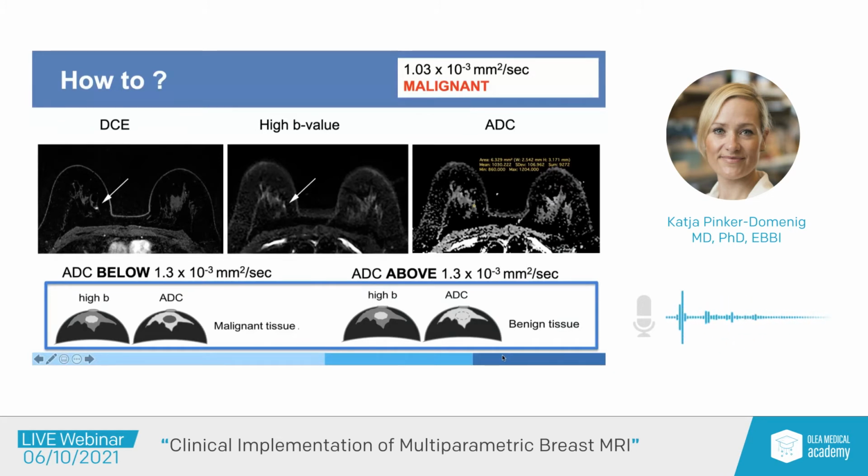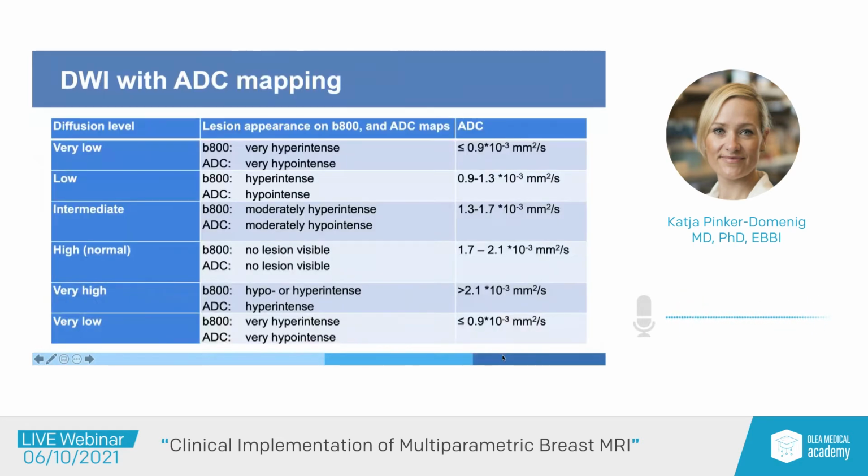Well, probably you would send that into follow-up and not necessarily immediately biopsy that. Well, in this case, it showed up with restricted diffusivity, and when we measured the ADC, it was 1.00 to 1.03. That is definitely suspicious, and we biopsied, and that was basically a cancer in this high-risk patient. So in that case, this is what pushed me more towards biopsy. In other cases, the DWI will confirm my gut feeling that this probably should be a follow-up.